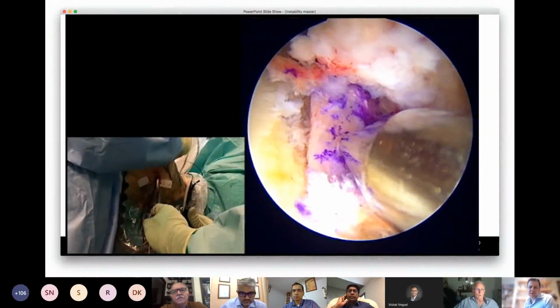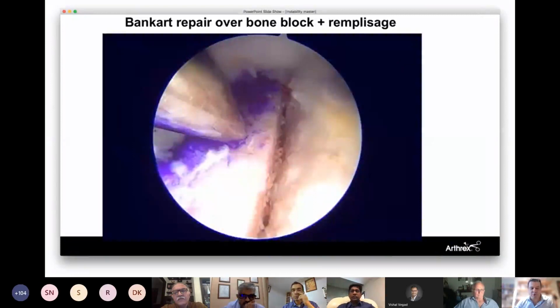with the tensioner. Just here, it's very important, they are very powerful, the tapes. So you can tighten it really much, but I once tried to tighten it to 90 newtons and then it just cut through the block with the tape. It's so powerful that you will never manage to rupture the tape. You will cut through the block. So you can tighten to maybe 70, it's enough.